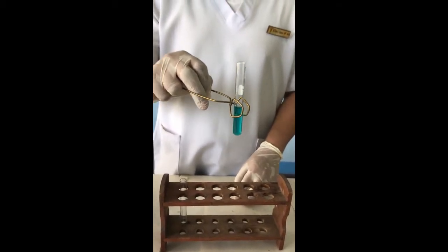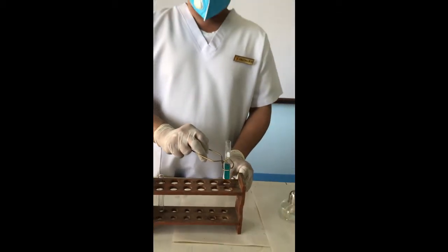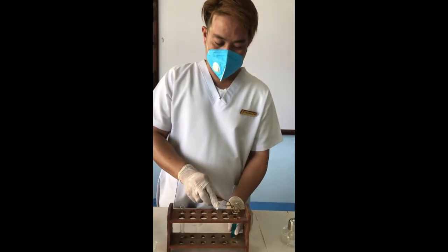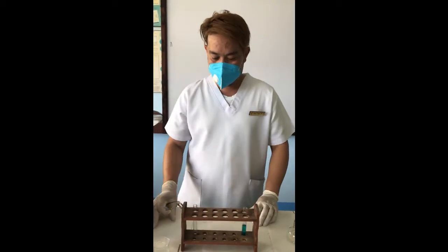If the urine color is yellow, it contains 1% sugar. Orange means 1.5% sugar. If it is brick red, it is 2% or more.